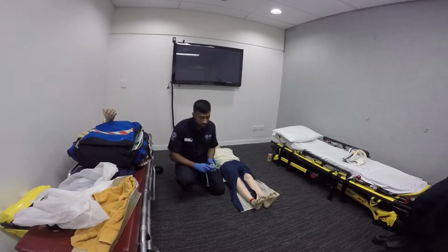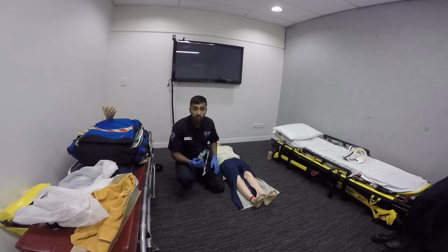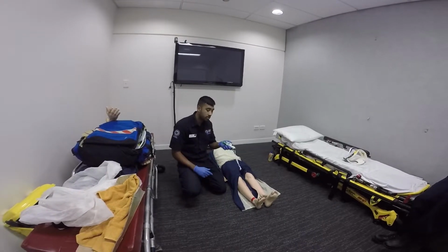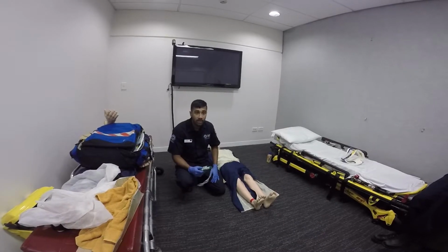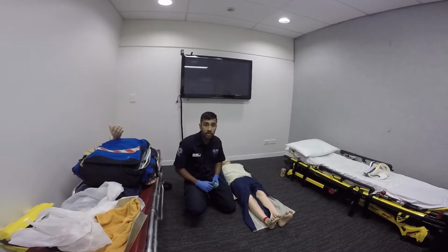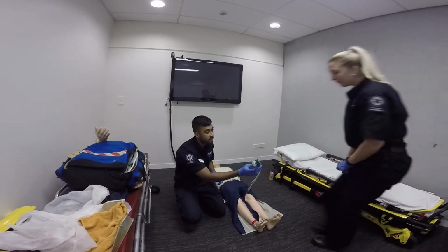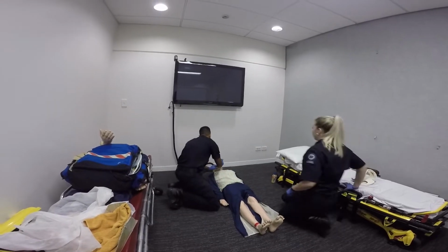So what I'm going to do is administer a drug called methoxyflurane, which is an inhaled analgesic. It's self-administered, so the patient just has to breathe it in. Contraindications can include renal impairment, a family history of malignant hyperthermia, and or if he's unable to obey commands. So I'm just going to do a drug check here, which is in date, and I'm going to give my offsider Shawnee the drug. Could you just double check that it is in date? Oh yeah, that's fine. Alright, so I'm just going to place that in here.